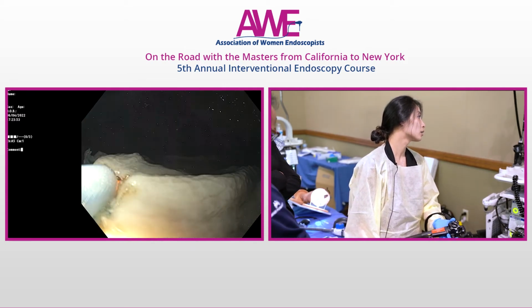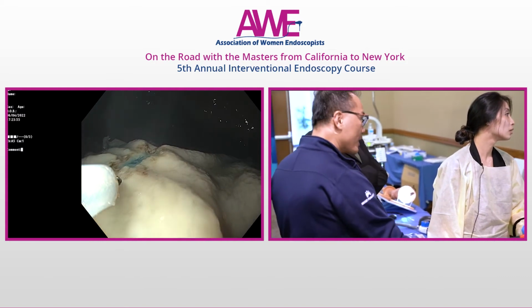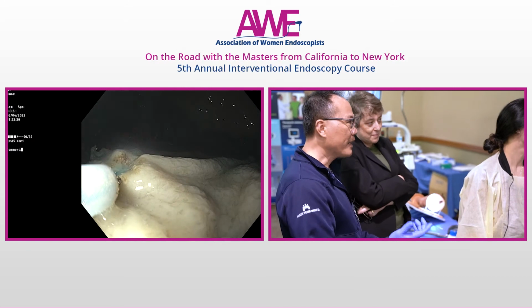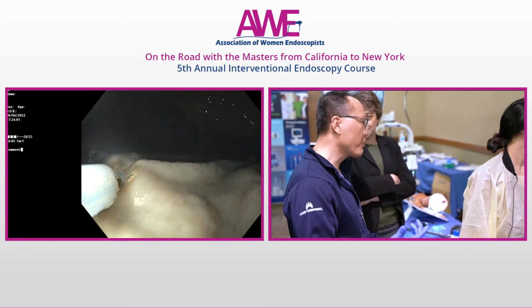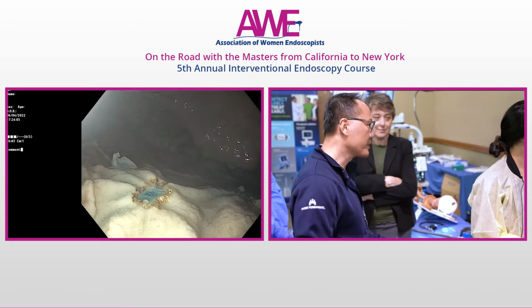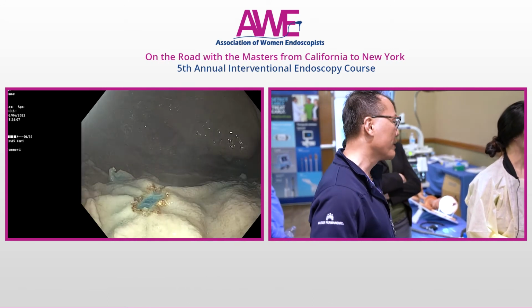The person who can also help Dr. Yang by holding the scope and torquing in certain directions, as you know. That's a great point. Having an experienced tech who works with you and can hold the scope in a certain torque position for you certainly allows you to do some of those difficult lesions as well.